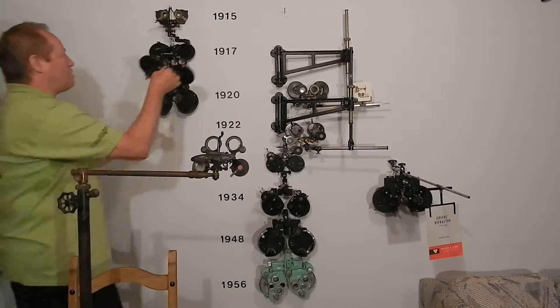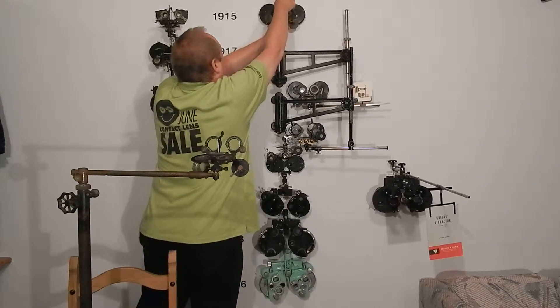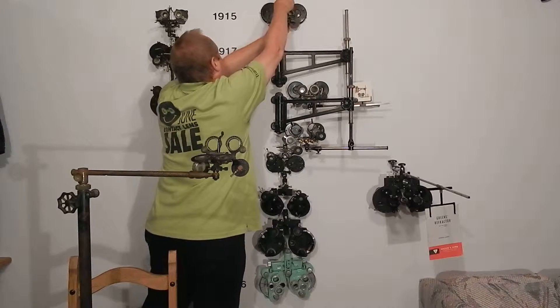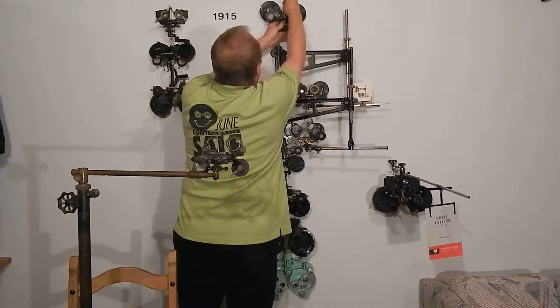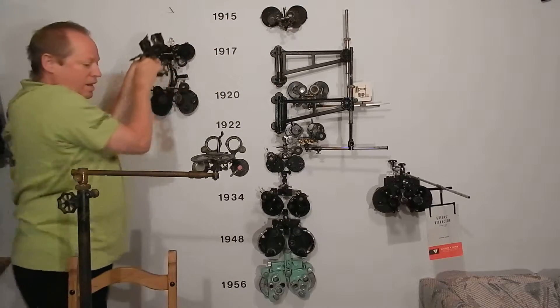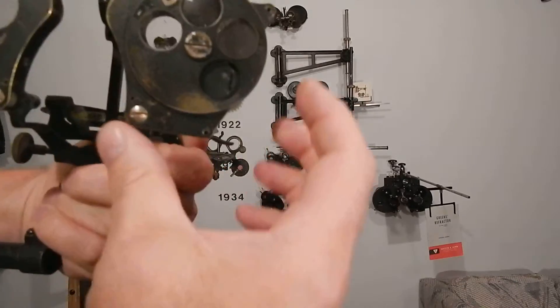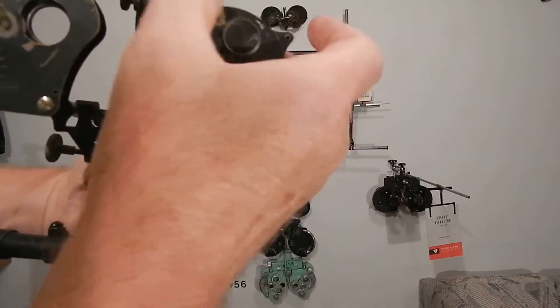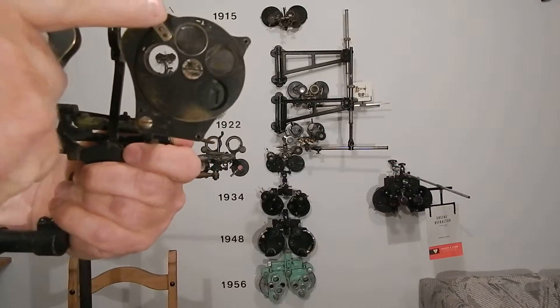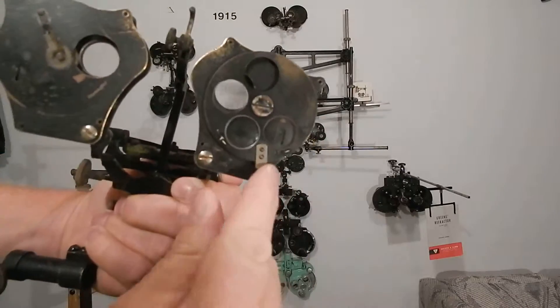I forgot to tell you about the other one — it has the same thing on the back. Look: plus six, minus twelve, minus six. It's the same idea — it increases the range so you can include all your patients.